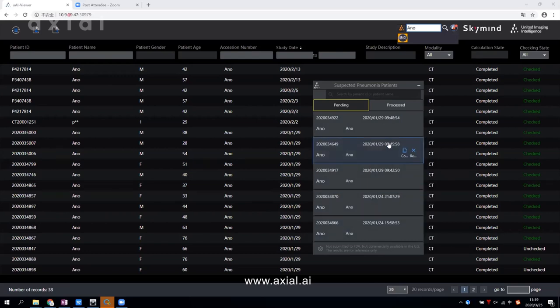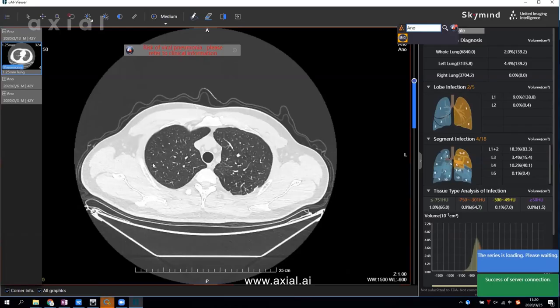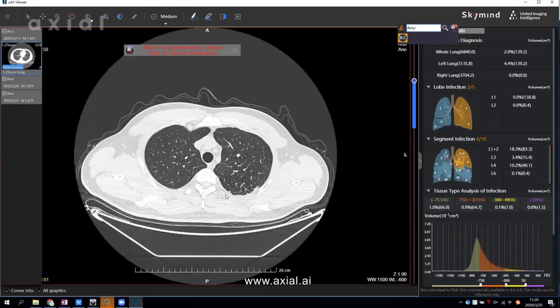Let's use this as an example. If I click this one, it will show the analysis report. You will see the CT image here.